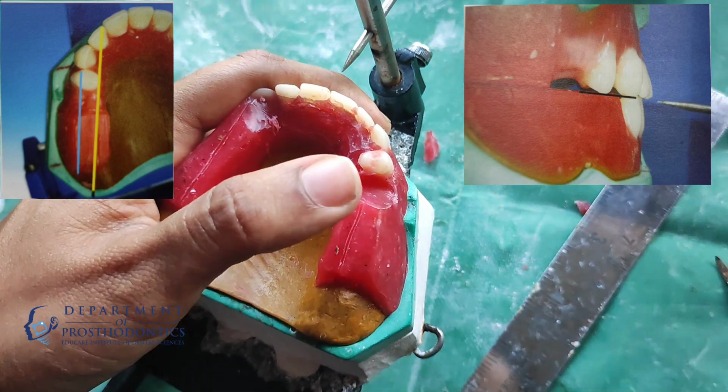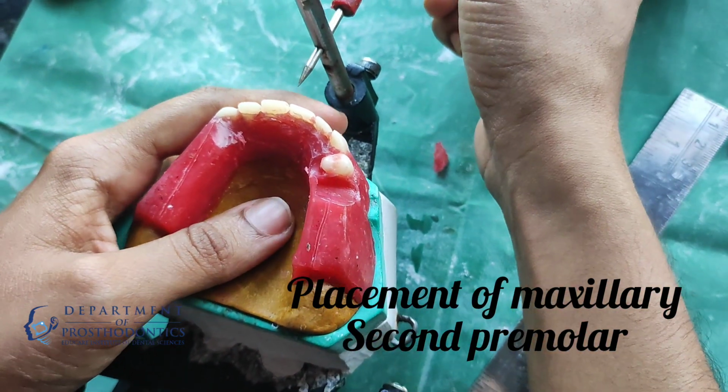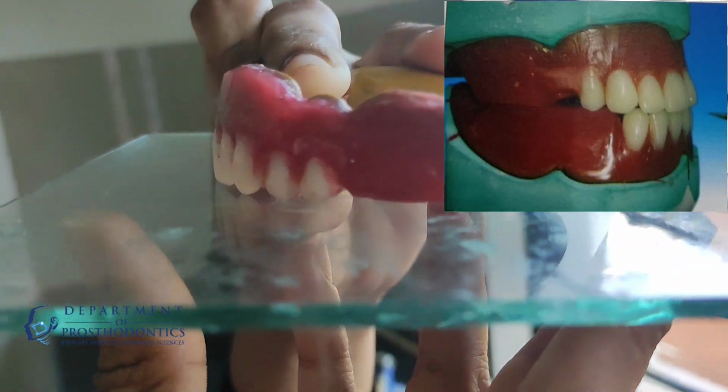Second premolar. The buccal cusp tip and the palatal cusp should be in contact with the occlusal plane, and the long axis should be parallel to the vertical axis.